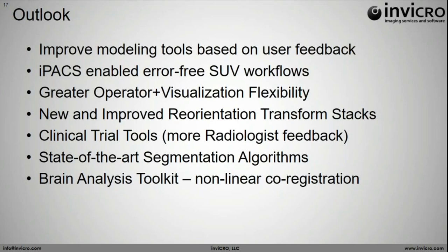And lastly, a few things up and coming that we've been working on. The modeling tools are certainly a work in progress. They've been designed with a lot of modelers in mind, and we've received a lot of early feedback from them. But we're really excited to see what the greater community does with them and what they see as the next pressing need. We certainly have ideas of how we want to enhance it, but we're excited to hear from the community on what they want to see in our next releases.